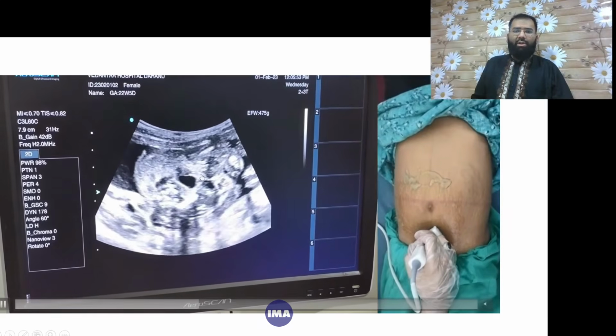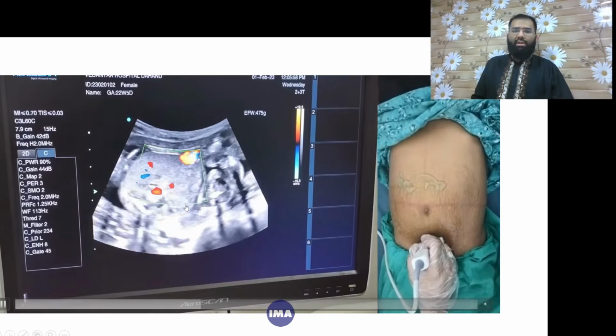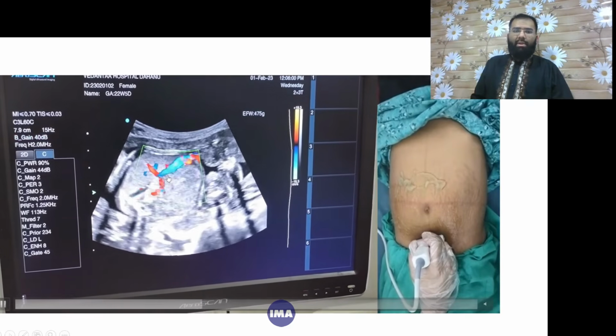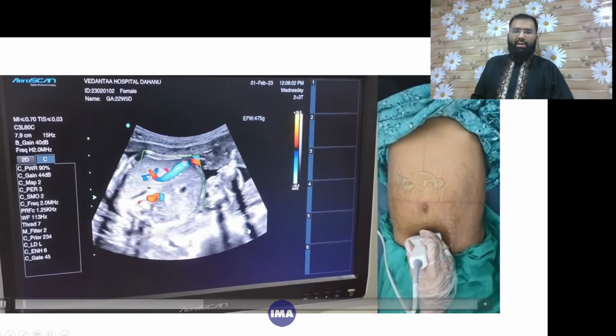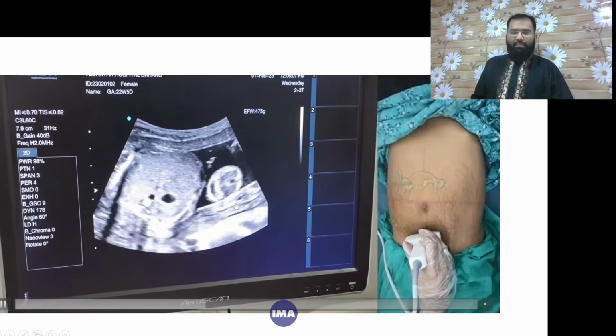Now this is fetal urinary bladder again. Now this is two vessel cord, which is seen alongside the urinary bladder. This is umbilical cord is entering, and you will see the aliasing where it meets IVC in the form of ductus venosus.